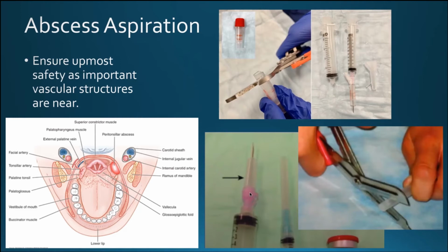Probably right around here. It's rather soft and pliable, so you'd be able to insert the needle through the backside of it, and this backside that would sit flush up against the abscess is smooth, and it's not going to have any jaggedness or anything like that to bother the patient any more than necessary.